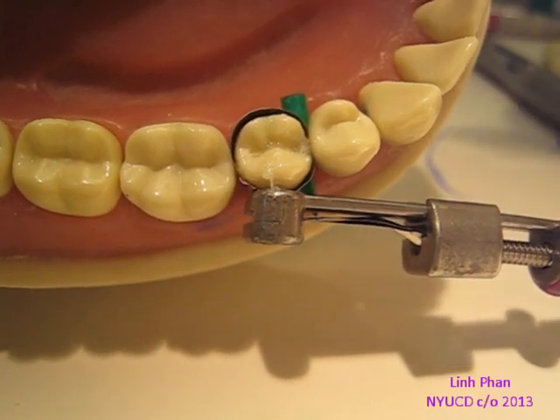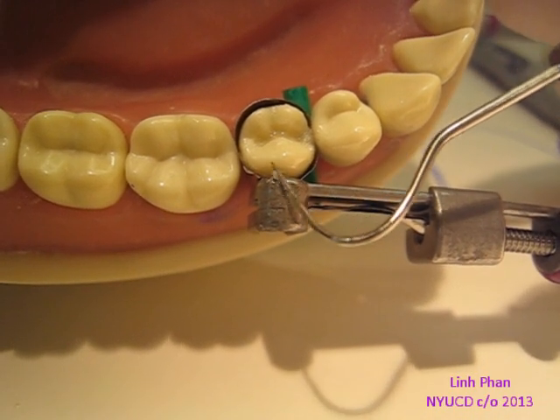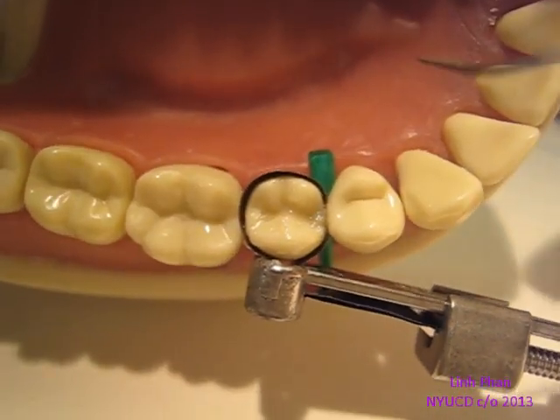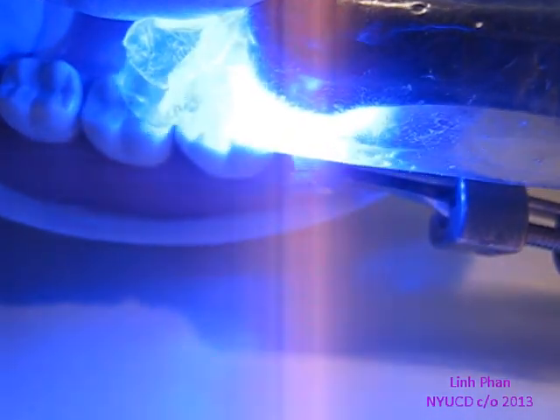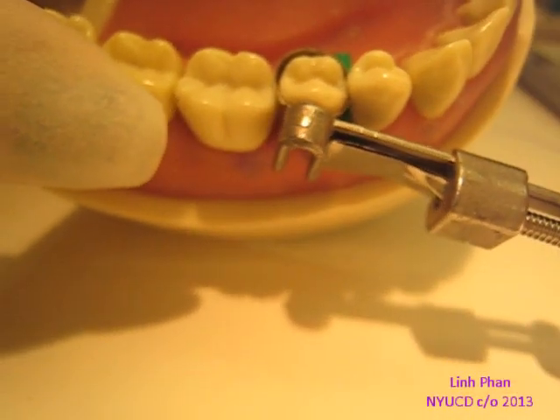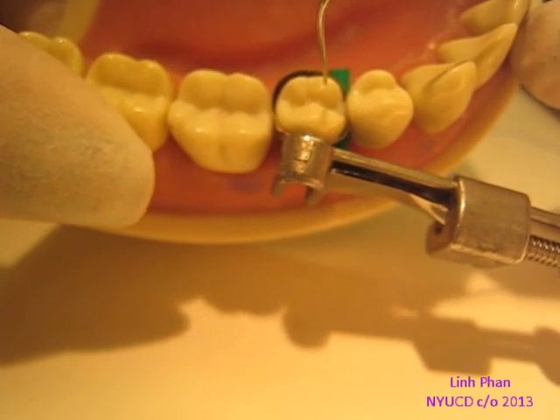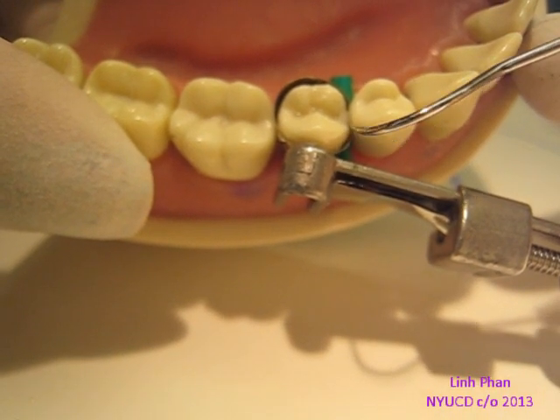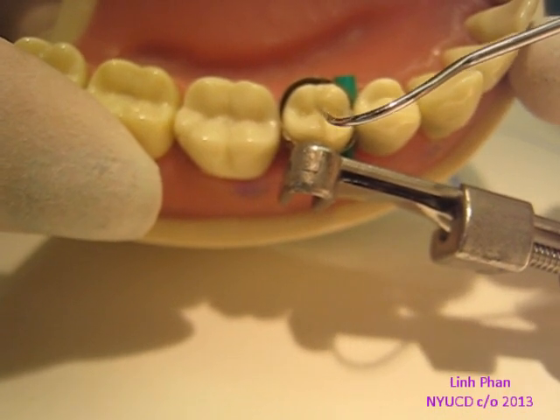Get rid of all the extra composite that you don't want to cure. Once you have a shape that you like, go ahead and cure it. Now that you have pretty much everything, go back with an explorer and make sure you don't have any underhang. Go and look to make sure your explorer doesn't catch on anything. If it does — like I think it's catching a little bit here — go ahead and add a little more composite right there. Right here it's smooth.